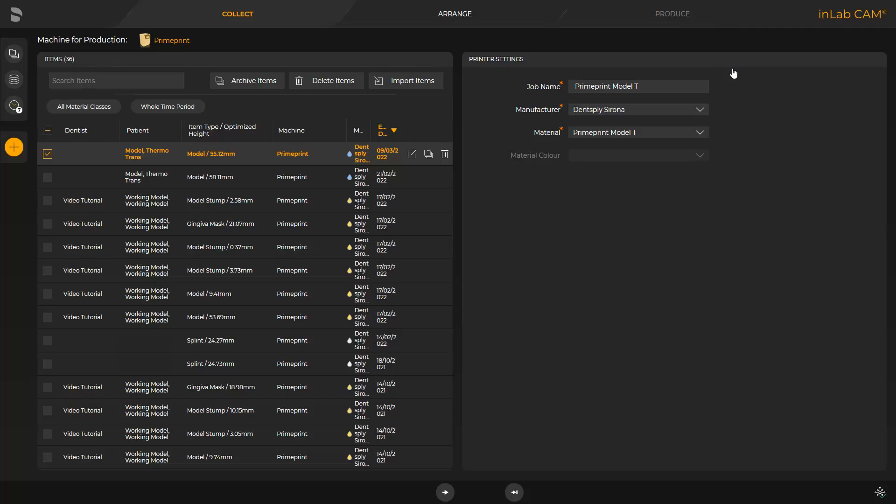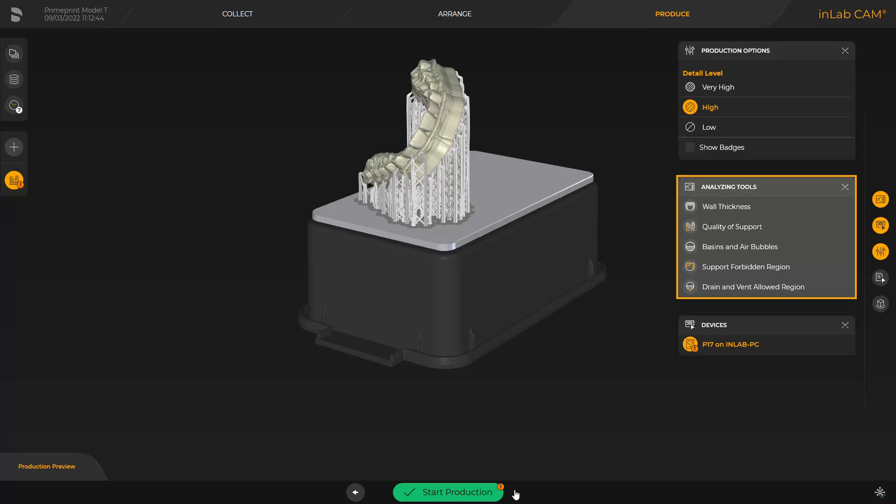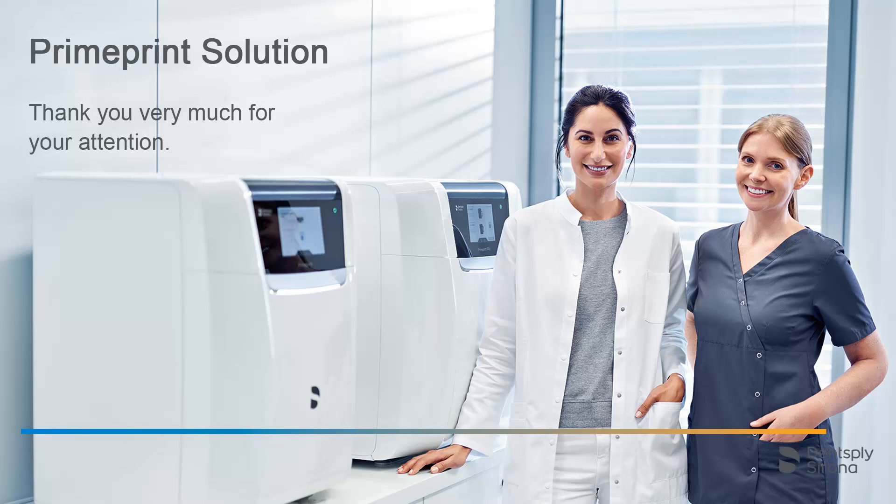Detailed information about the InLab CAM software can be found in a different video tutorial. We click on the double arrow and can modify the detail level in the window under Production options and analyze the print object with the analyzing tools to finish the process. To start printing, we tap the green area labeled Start Production. Thank you very much for your attention. We would like to wish you every success when working with PrimePrint Solution.